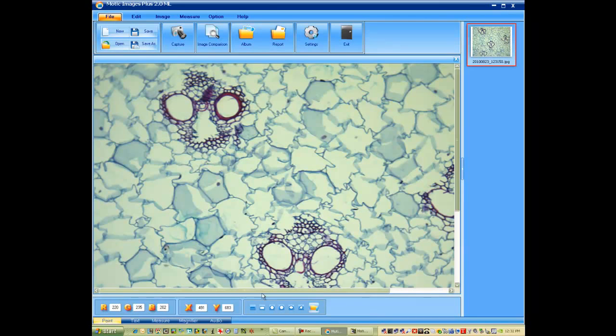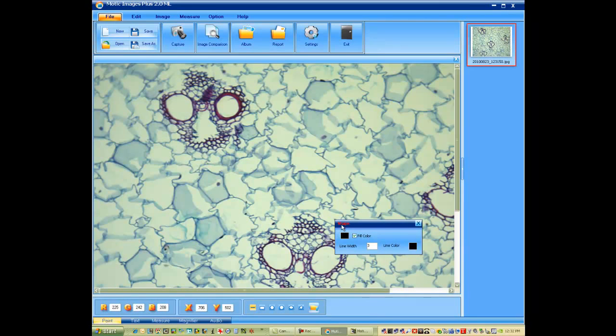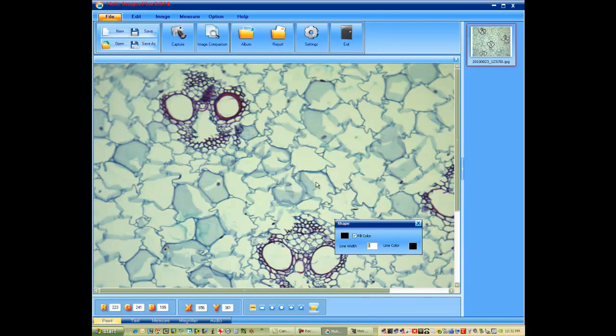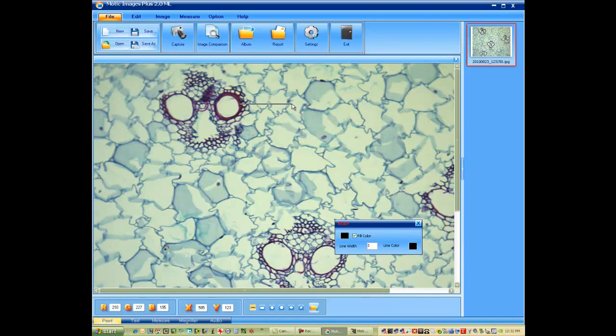And then you're free to go in and label it. For labeling characteristics, you can choose your line color. In this case we're going to use black. You can change the thickness of your line and the fill color. Once you've selected that, you can simply go in and identify the structures that you'd like to label.